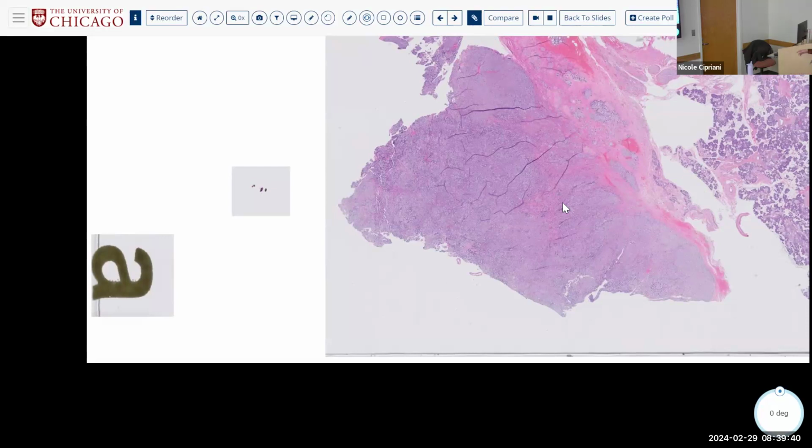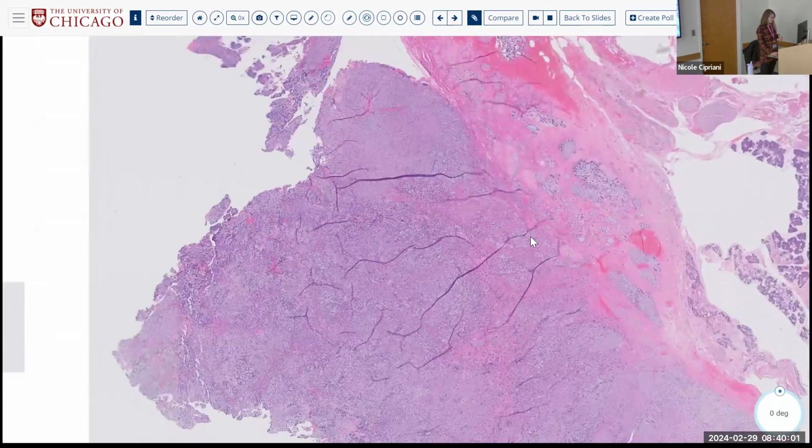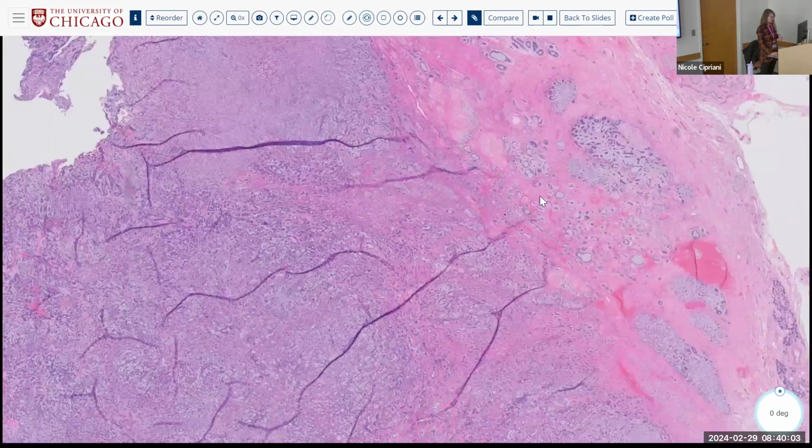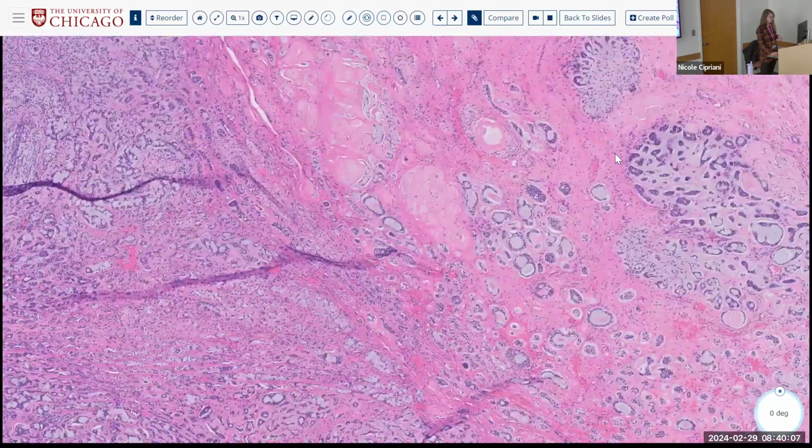Yeah, exactly. So then we're down to maybe an epimyoep, right, or an adenoid cystic. Favorite thoughts based on what you saw in the core? I don't really see cribriform, which I know you don't necessarily need to see on a core, but makes me question where it's at. Epimyoep. Okay, so let's look, and sometimes, right, core can be deceptive.